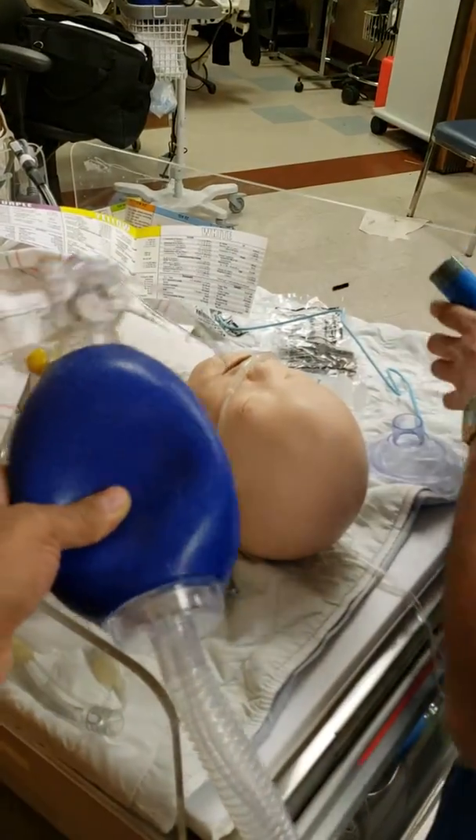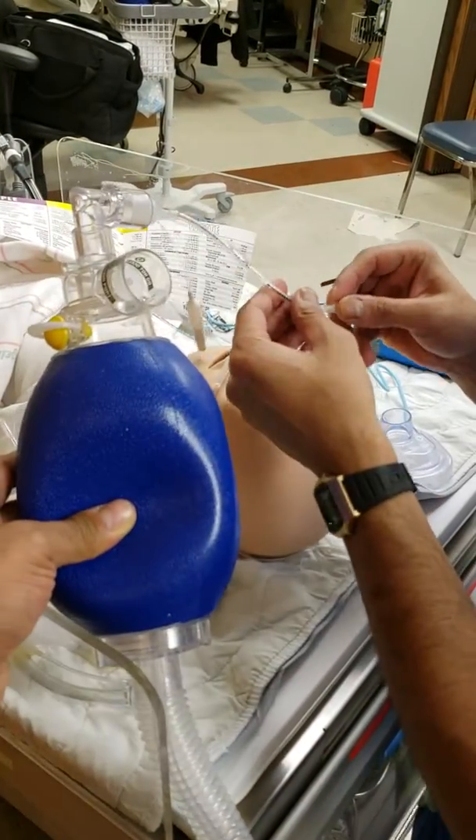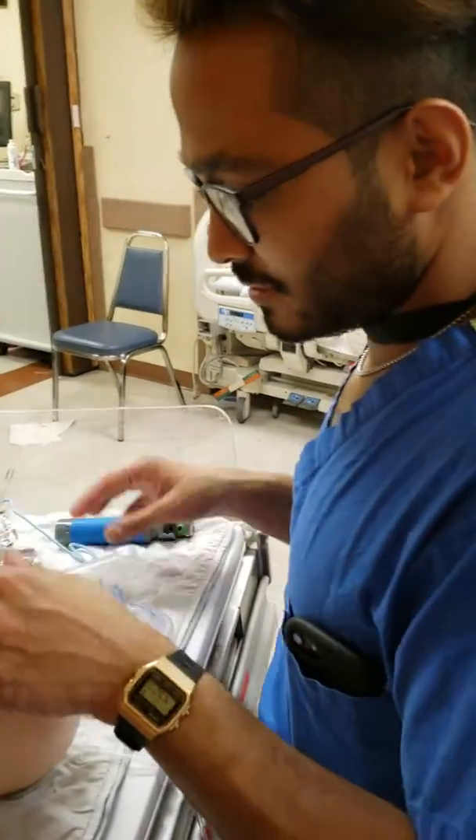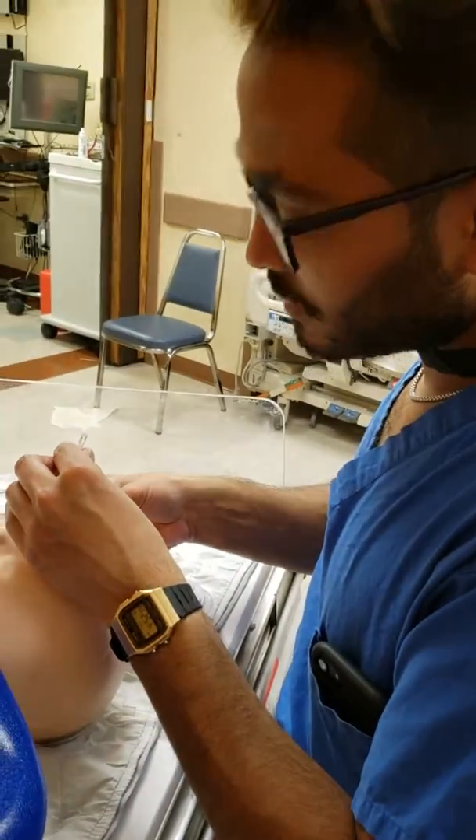So next time — I think it's the mannequin itself. Look how long this is. It came out. Was the cuff working? It looks like it's working. Did you test it out before you put it in? No.